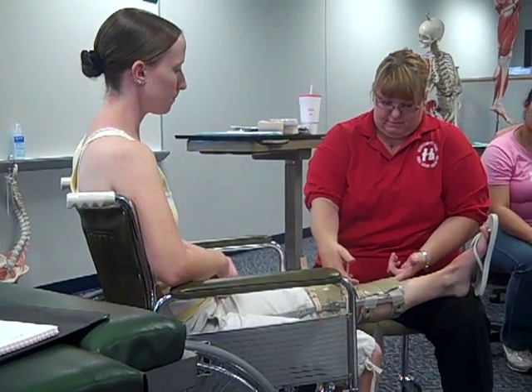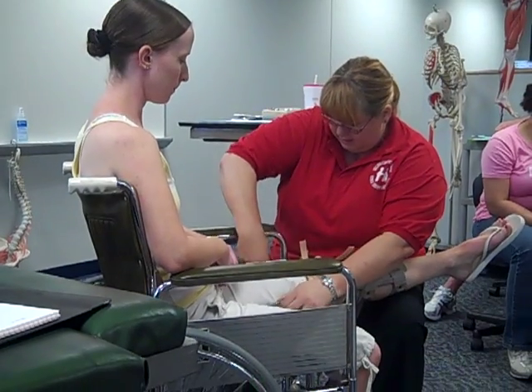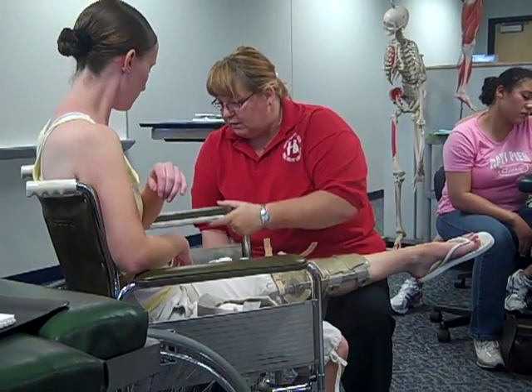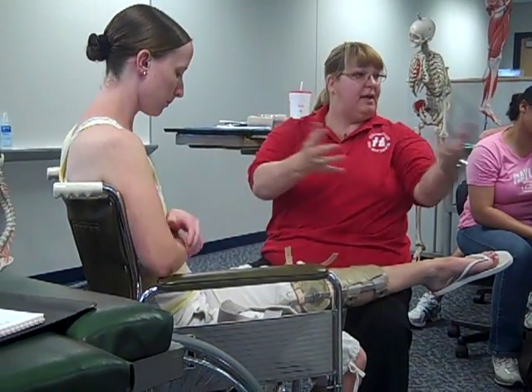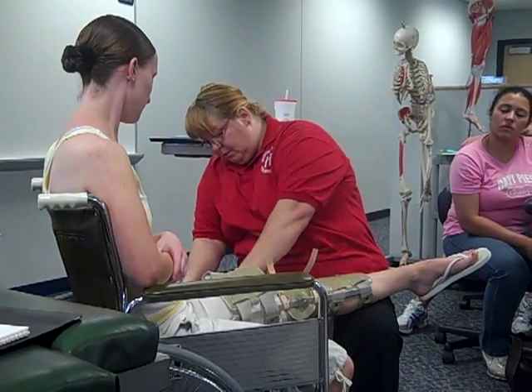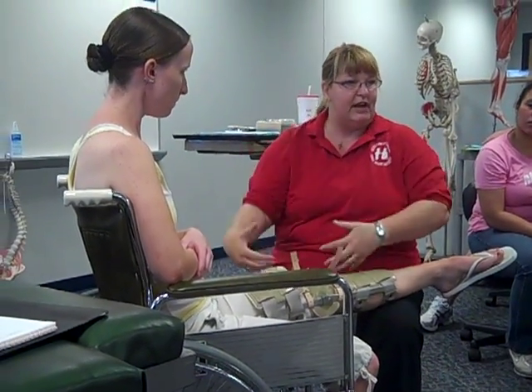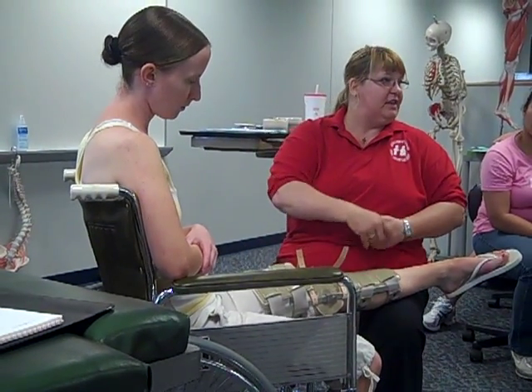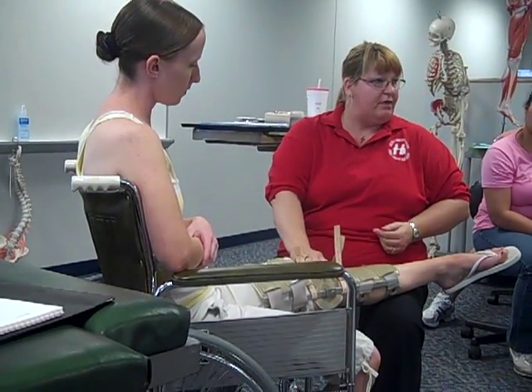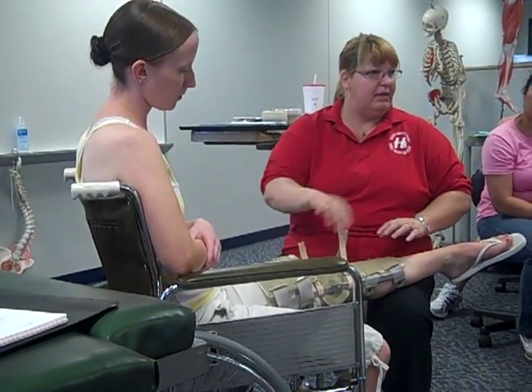Everything feeling comfortable? I'm checking again to make sure nothing's folded over. I could also have the patient scoot forward or tilt her legs to the side to access the straps. Make sure the pads cross the patient properly. I'm not going to take time to do the rest of these — you get the idea: tighten, check, retighten if needed. When she stands up, this just holds her in that nice straight leg position. Apply the knee brace or knee cuff first, then either the thigh or shin strap — it doesn't matter which order — but the knee strap has to come before those two.